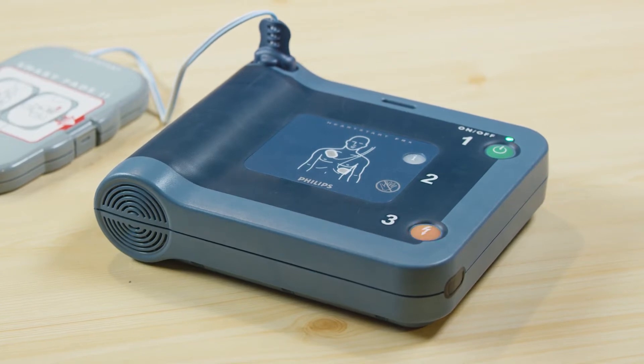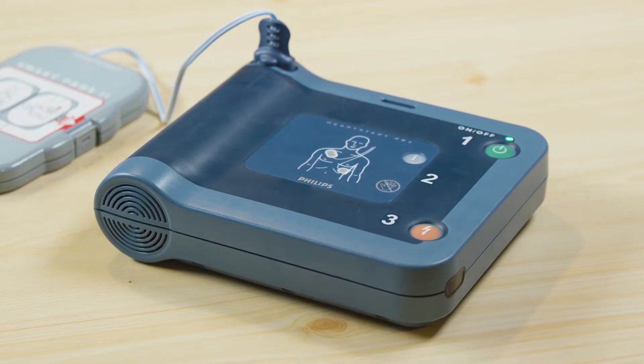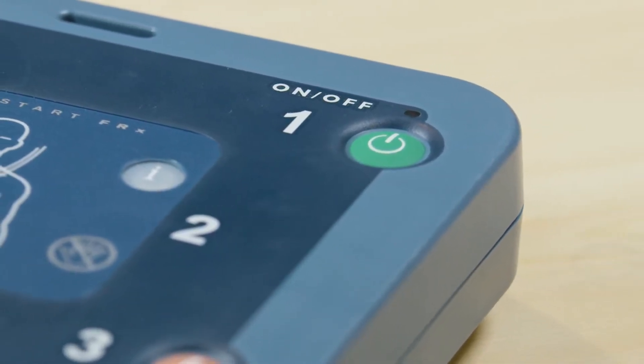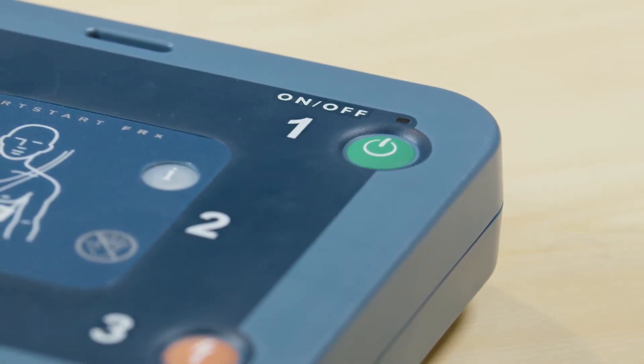The FRX will say 'Shock Button Test' and prompt you to press the shock button. Next, the FRX will say 'On-Off Button Test' and prompt you to push the On-Off button. Push the On-Off button when instructed to do so. When the self-test concludes, the unit will report the results and then enter standby mode. The ready light will start blinking green, showing that the HeartStart FRX is now ready for use.